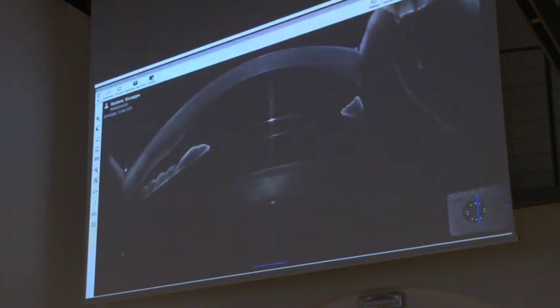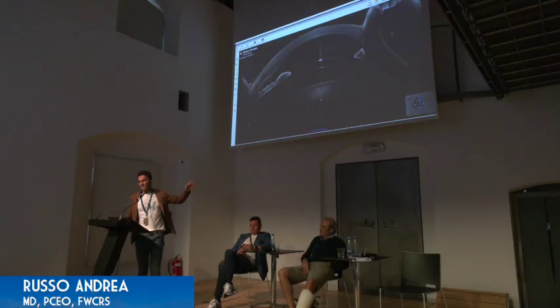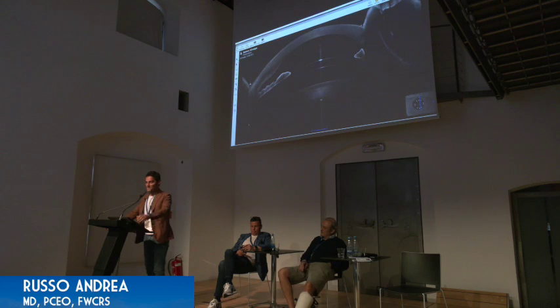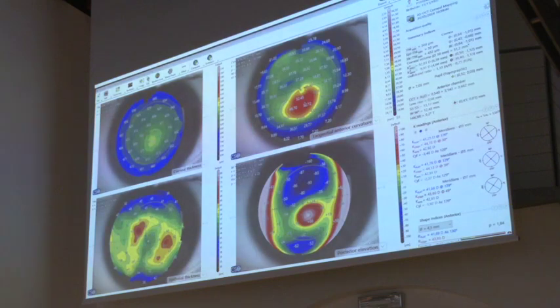So once again, it's really helpful in understanding the position of the haptics of the ICL. And we also did the UBM, and we found some cysts in that position. That's why we decided to rotate the ICL. Another nice case, another keratoconus, as you can see.